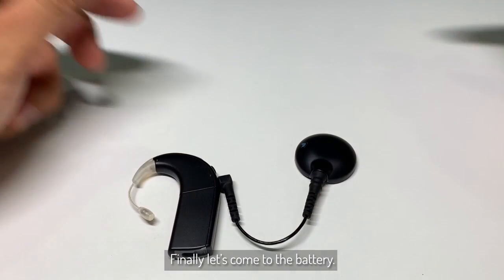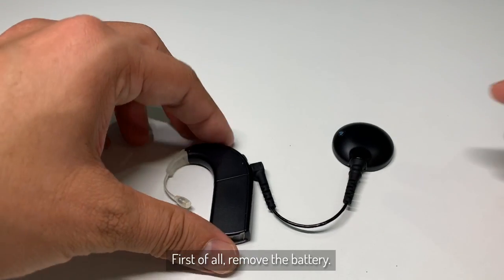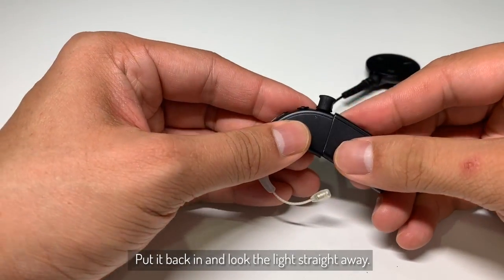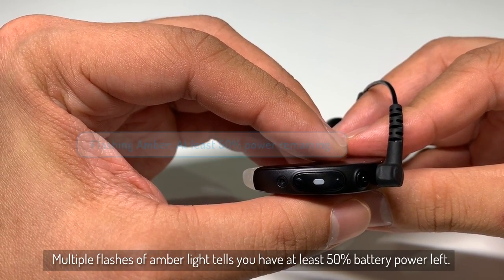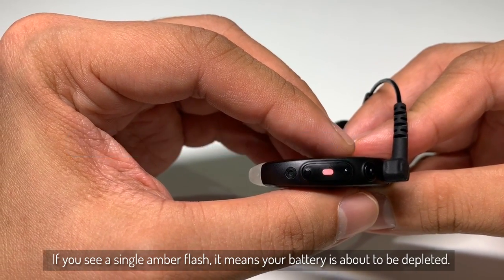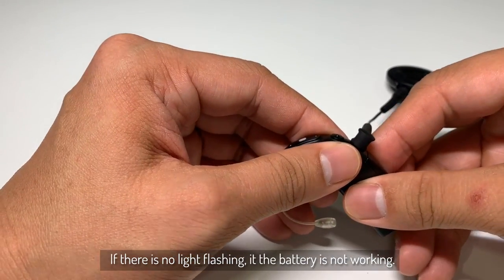Lastly, when it comes to the battery — when it comes to troubleshooting your battery, always make sure you have a fully charged battery. How can you tell? First of all, remove the battery, put it back in and look at the light straight away. Multiple flashes of amber light tells you that you have at least 50% battery. If you have a single flashing amber light, that means your battery is about to be depleted. If there is no light flashing, that means that the battery is not working.